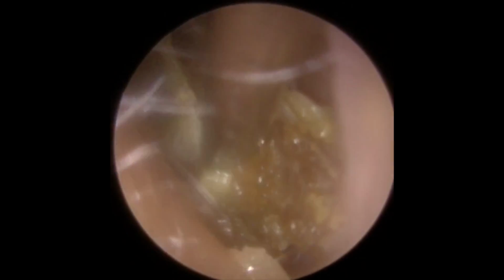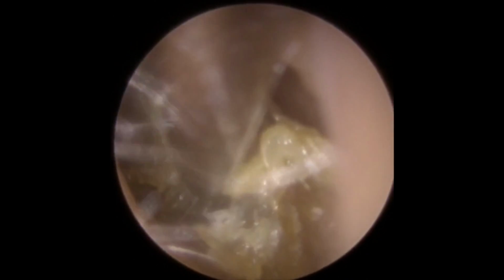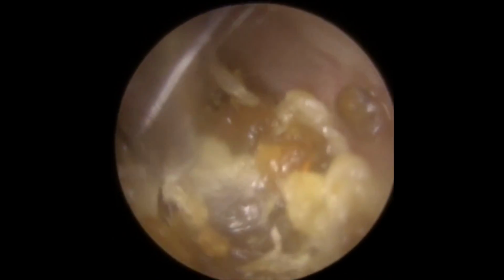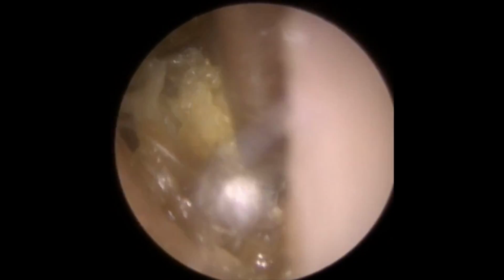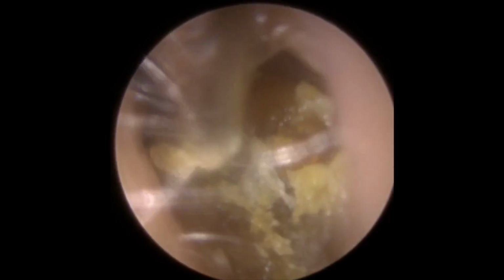Using that drier skin, it's more flexible, it's bendy, it's going to get sucked into the end of the suction tube really well, which is going to give us a slightly better grip. Sometimes this will be a ribbon that's running through the wax, so if you can break that away, it collapses the integrity of the block of wax. You can see that's what's starting to happen there. As we pull, we can see this back section here has become very loose. So if we can get this section out.